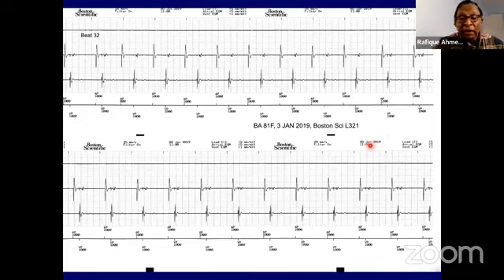This feature, any feature in a pacemaker, wastes battery. Even if you save one month of battery, it's important. So features that are not necessary should be turned off in pacemaker programming to make the pacemaker simpler.